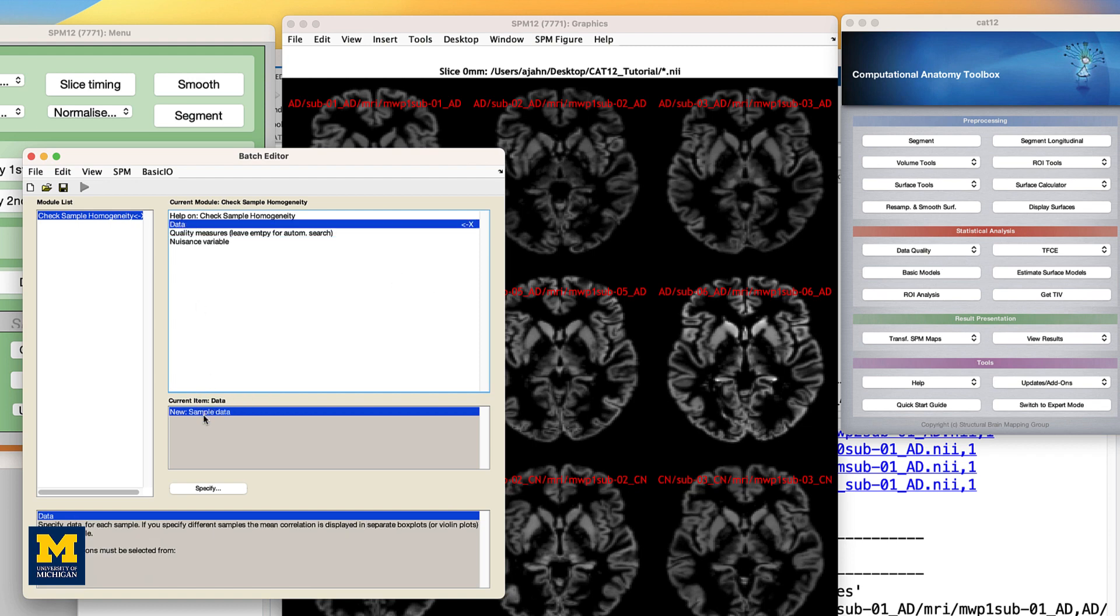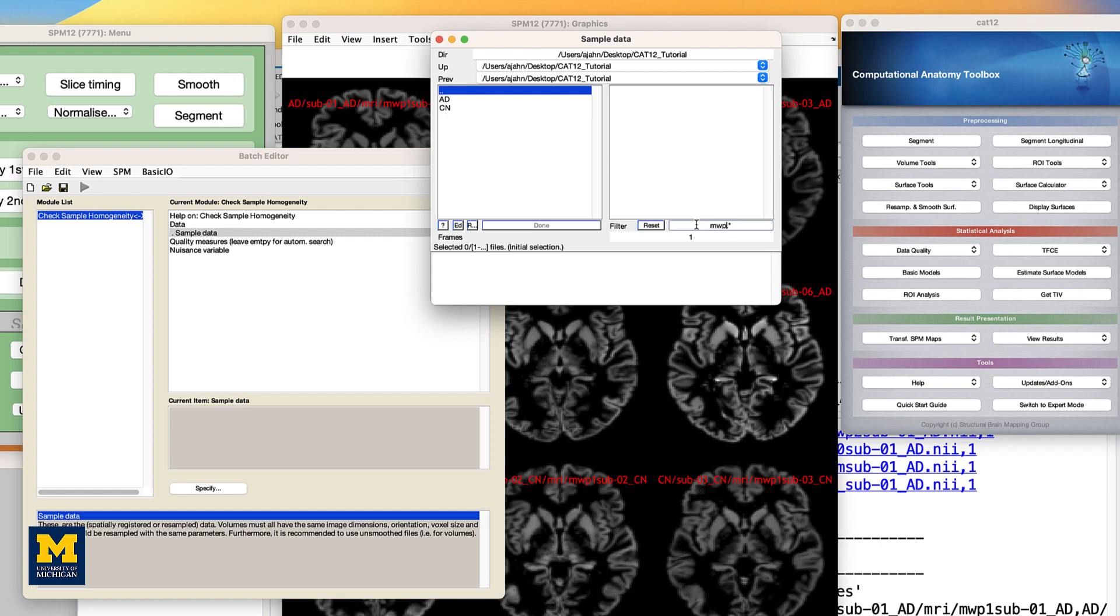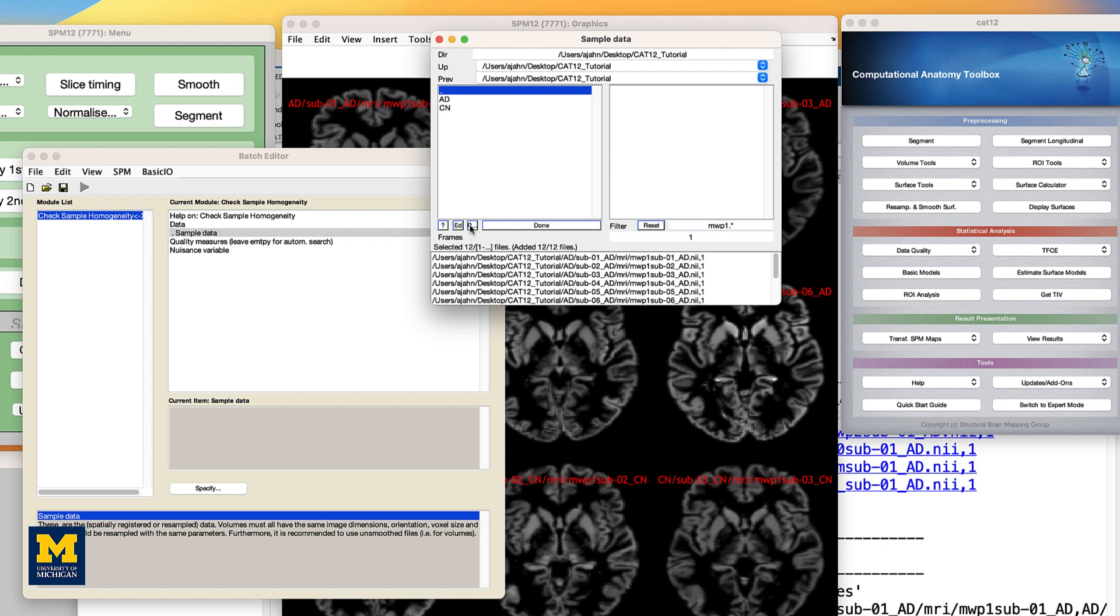Click on data, and then new sample data. From there, double-click on sample data. Similar to before, use the resulting selection window to navigate to the CAT12 tutorial directory containing your AD and CN folders, and then enter the string mwp1 and click the REC button. Once all 12 files are selected, click done.